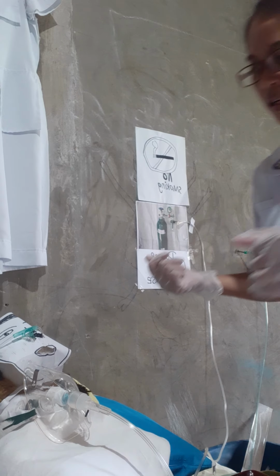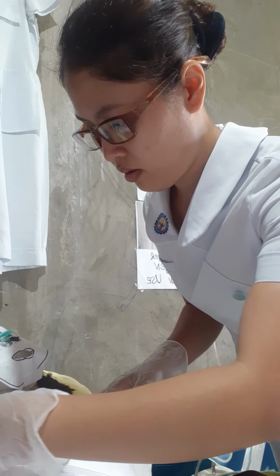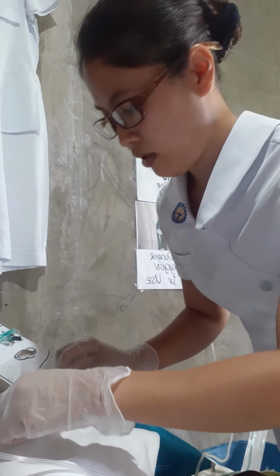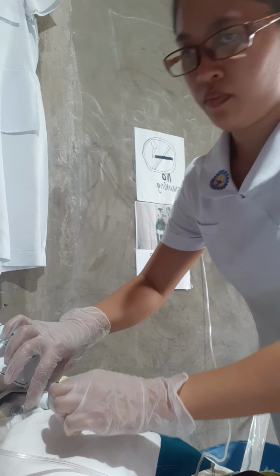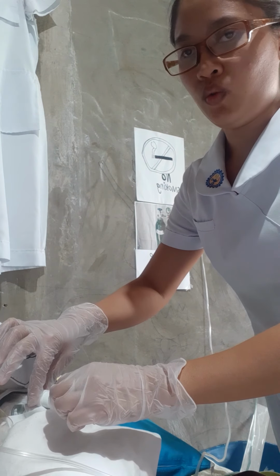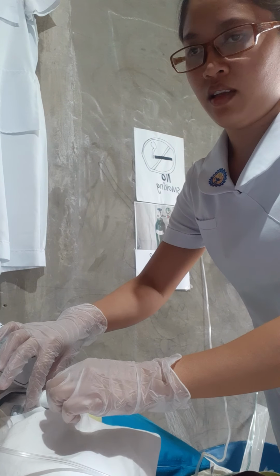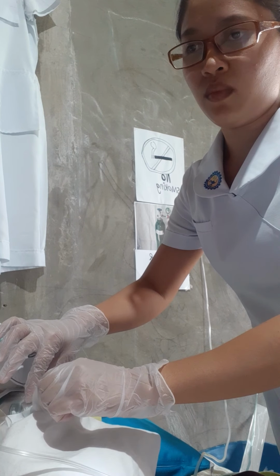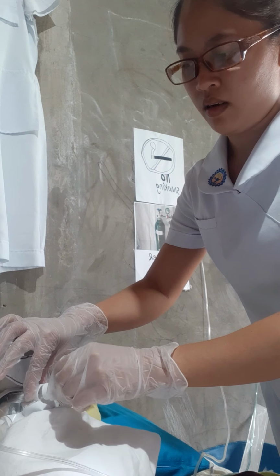Then we need to remove the source of oxygen. Excuse me, sir. And we need to remove the dressing, and then afterwards, we need to hold the faceplate, and we need to rotate this inner cannula counterclockwise and release.